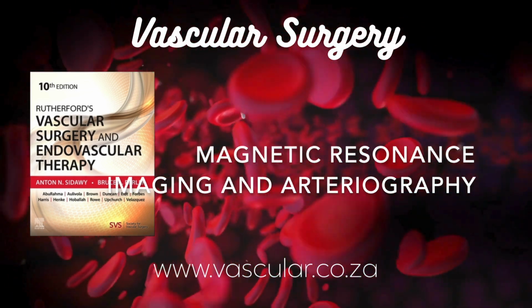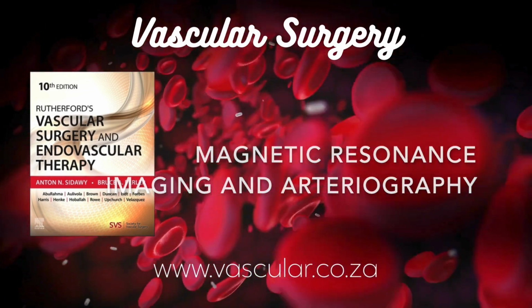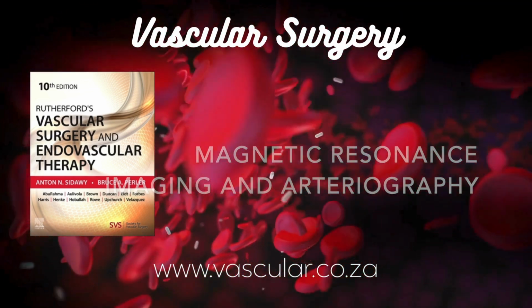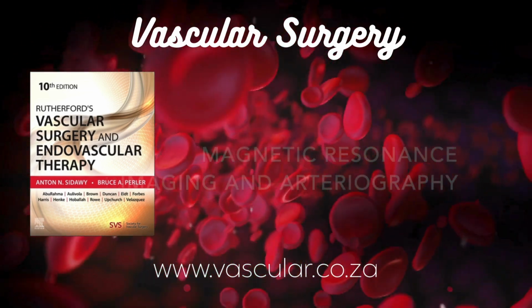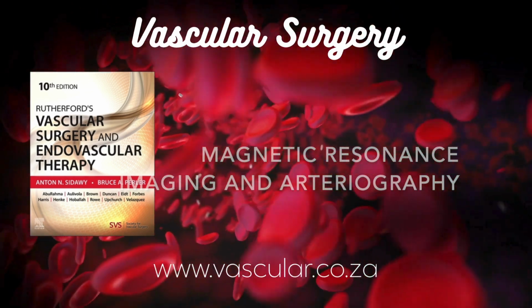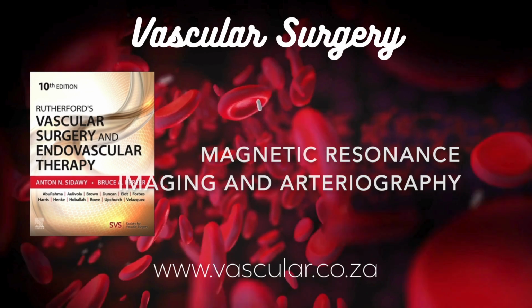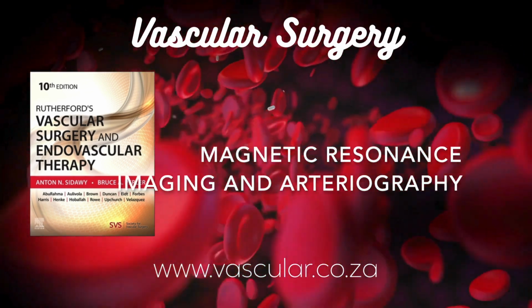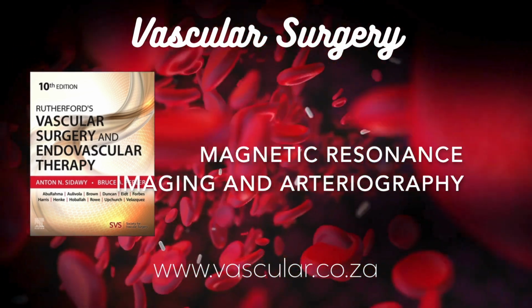And contrast risks. We covered the gadolinium NSF issue in kidney disease. CTA uses iodinated contrast, which has a higher rate of general allergic reactions and its own risk of kidney injury. Contrast-induced nephropathy, especially in patients who are dehydrated or have borderline kidney function. Practicalities. Ease of use. CTA scans are much quicker, less time in the machine, fewer breath holds usually. So often more convenient, maybe better for claustrophobic patients or those who can't lie still. MRI setup takes longer, more sequences.